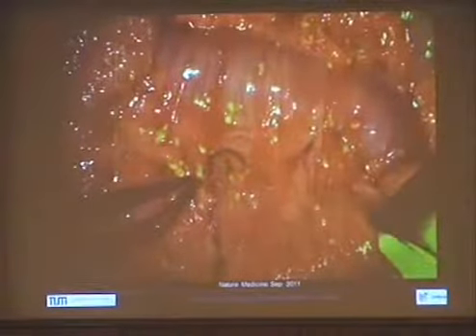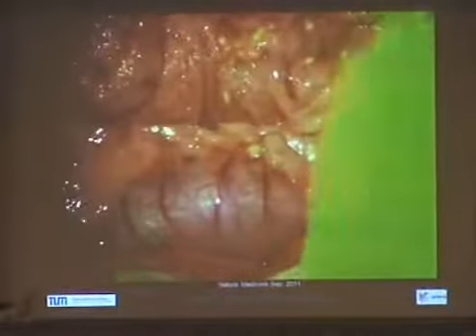So 6 surgeons got photographs and then got this type of images. And they could identify, you can find in this publication, 5 times more tumor based on the fluorescent signal in this particular case, which is, of course, a difficult case, but it just shows the potential. And here you see just an overlap because the surgeon moved his hand in.